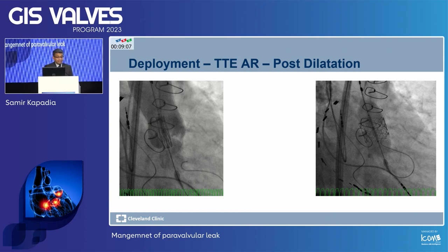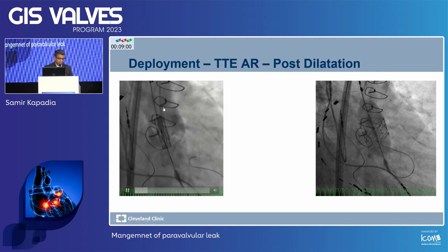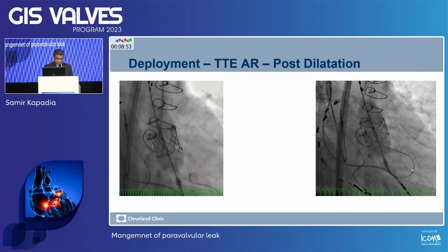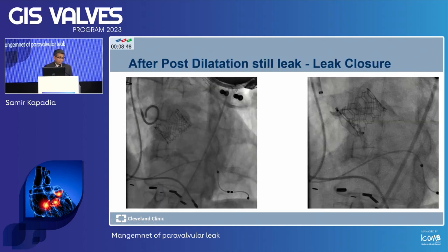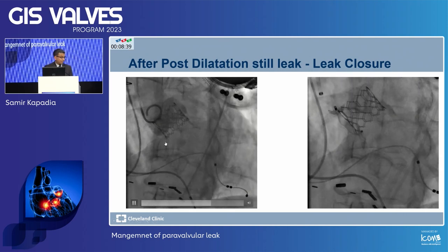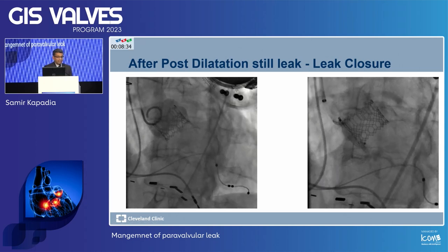This is a young patient and we are doing a valve replacement. I leave a straight flush catheter — so instead of a pigtail, a straight flush, so you don't have to remove it. We deploy the valve, and after valve deployment, always do an aortogram. I know we saw much more AR than this, but this AR is not acceptable to me. We would say this is at least moderate AR.